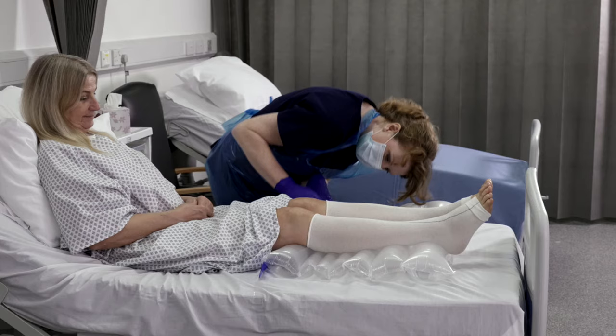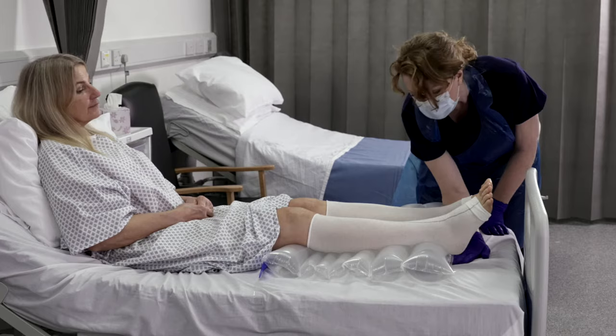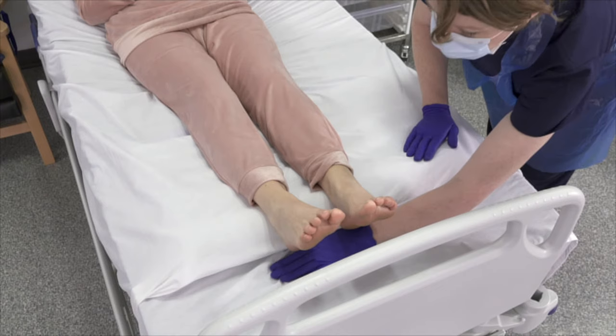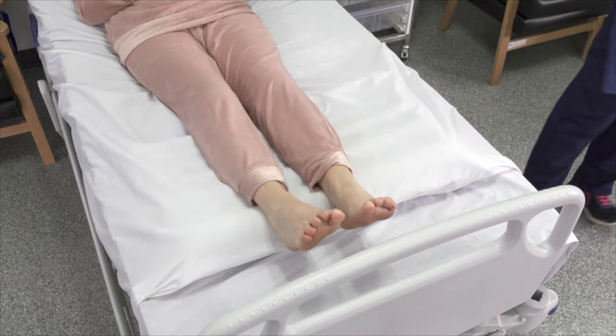Position the large air cell at the other end of ReposeFlex directly behind the knee to provide a slight flexion of 5 to 10 degrees and allow complete heel offloading. For additional comfort, drape a loose sheet over ReposeFlex, ensuring the sheet is tucked under the foot end of ReposeFlex to allow offloading of the heels. Do not tuck the sheet under the end of the mattress as this will cause the sheet to hammock, reducing the effectiveness of ReposeFlex and increasing the risk of potential damage to the heels.